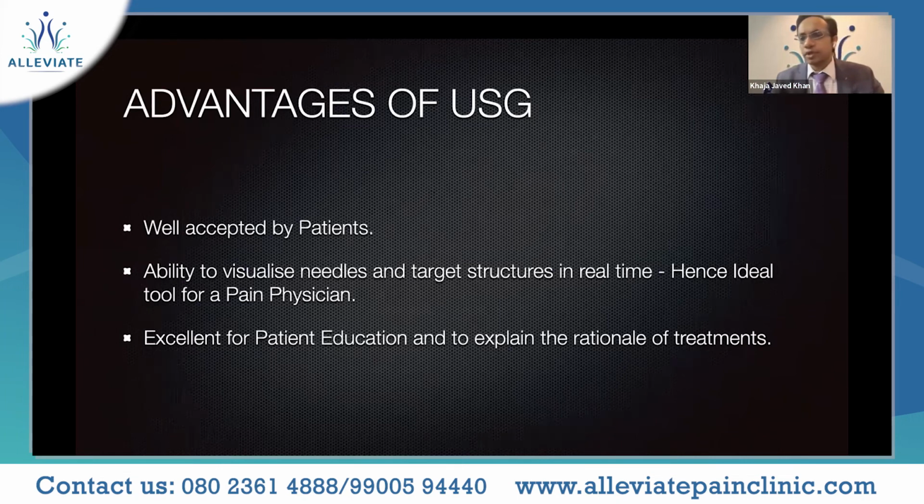Regarding what conditions are there, many a time most patients tend to have some understanding if you explain well. So the patient also becomes a part of your consultation and explanation process. Ultrasound also gives us the ability to visualize needles and the target structures in real time, making it one of the ideal tools for a pain physician. It's excellent for patient education and to explain the rationale of the treatments.